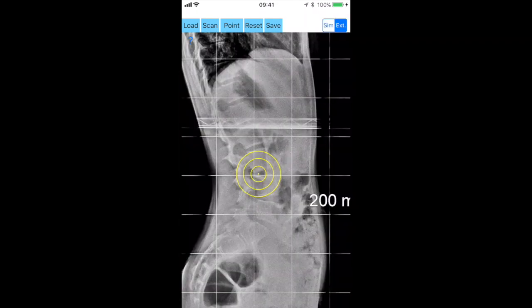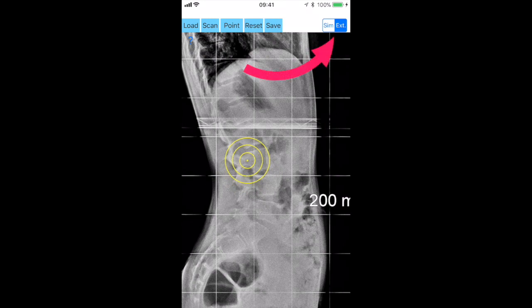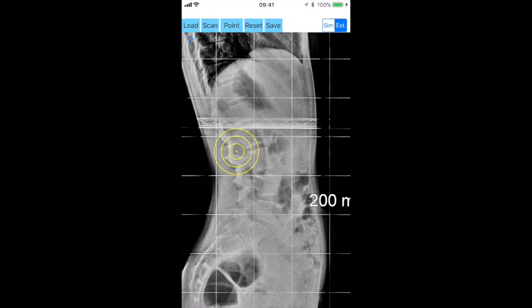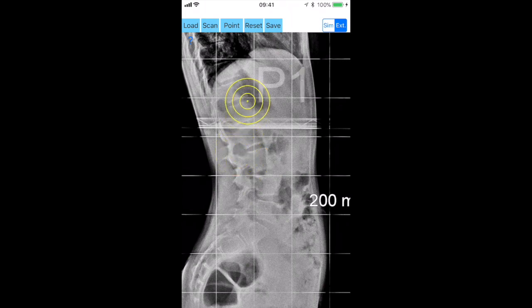For the extended method, once you press the XT button which is highlighted and the extended method is activated, instead of marking the S1 vertebra you aim to mark the L1 vertebra. By clicking the point button, the point P1 over the left edge of the superior end plate of L1 is marked, and by the same manner locating the right edge of the superior end plate, the point P2 is also marked.